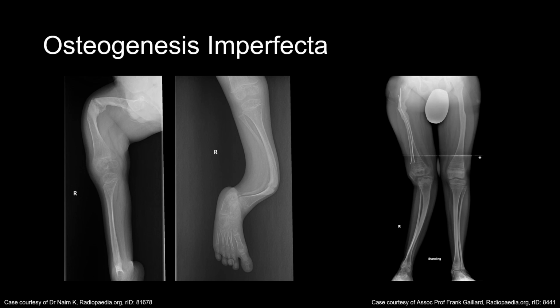Here are a set of examples showing some of those thin, gracile bones that you tend to get along with fracture, and then here again another fracture within the femur, sometimes creating pseudo-articulations, so joints essentially where they don't belong. Here again another set of very thin and gracile wavy bowed bones with a fracture here in the proximal femoral diaphysis.